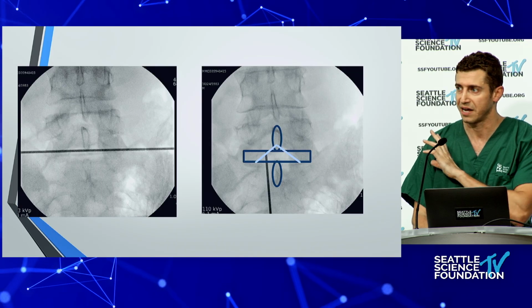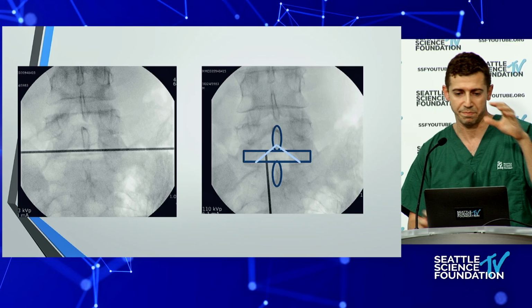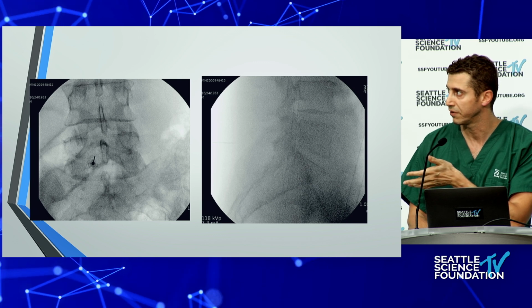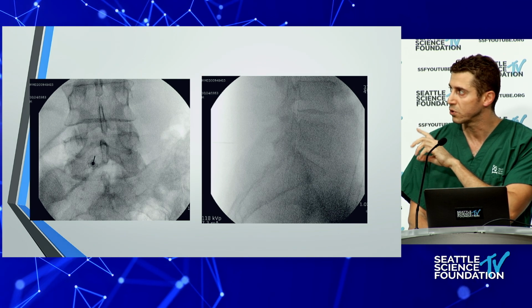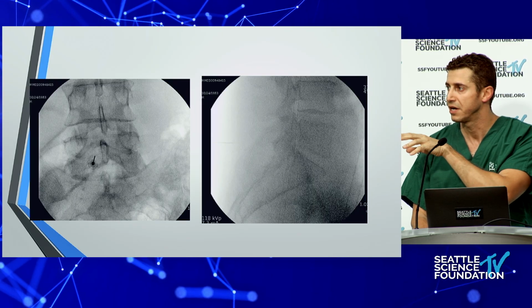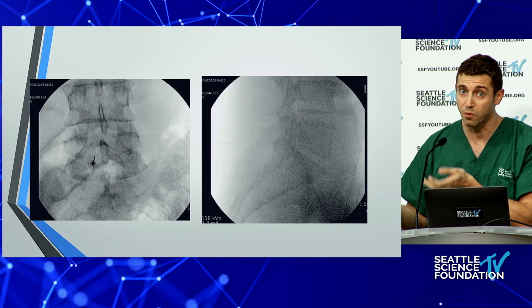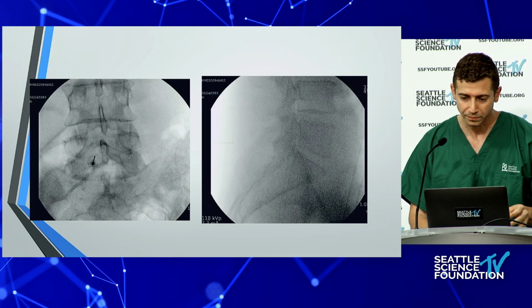So after you get this ideal picture intra-op, a perfect AP X-ray, and then you tilt the patient or the X-ray to get this view, that's when you're ready to go. You check the levels, make sure you're treating the correct level. As you can see here, unlike doing this through a tube, most of the time you're not in line with the disc space. You're kind of creeping up from underneath. The reason is that's what maximizes the interlaminar window and allows you to do these surgeries with minimal removal of bone, or no removal of bone, which is usually the case at L5-S1 in young patients.